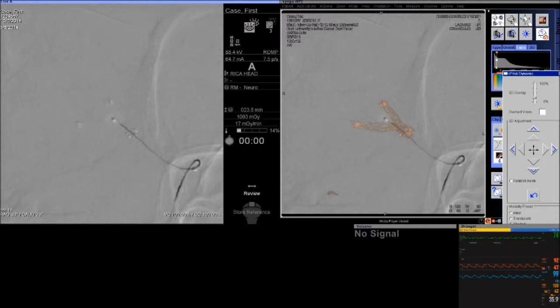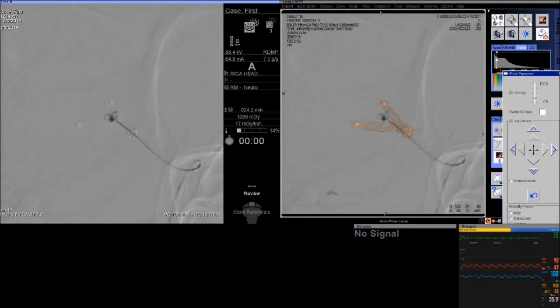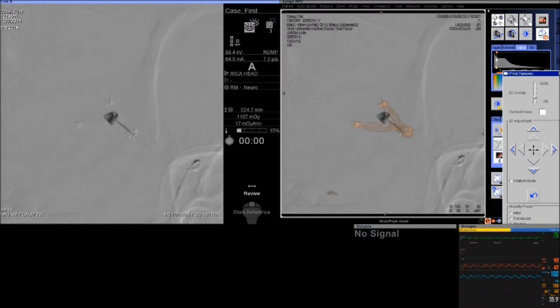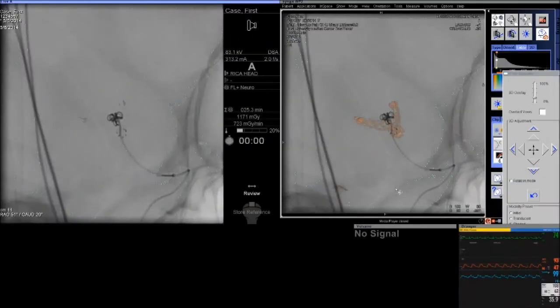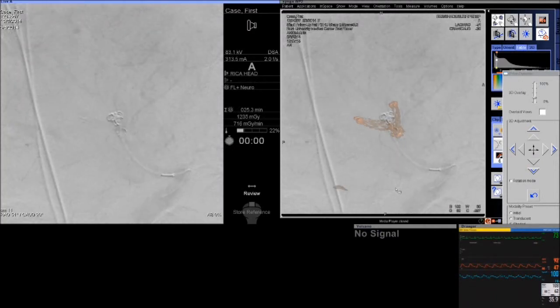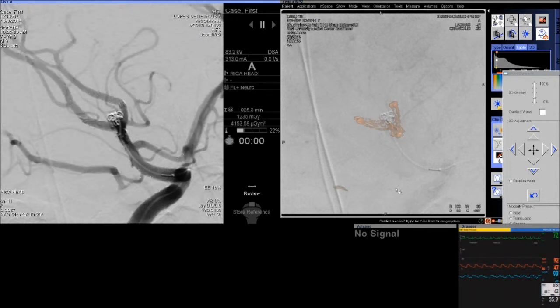In this case we place the first coil — I generally use a very soft, ultra-soft 360 coil that is undersized. The concept of undersizing is that we have significant protection at the neck of the aneurysm, and I want coil placement to be as easy as possible without a lot of pushback requiring the microcatheter to move in and out of the parent vessel. Once you have access to the aneurysm, it's very important that your microcatheter stays there so you can place all the coils without excessive catheter manipulation.